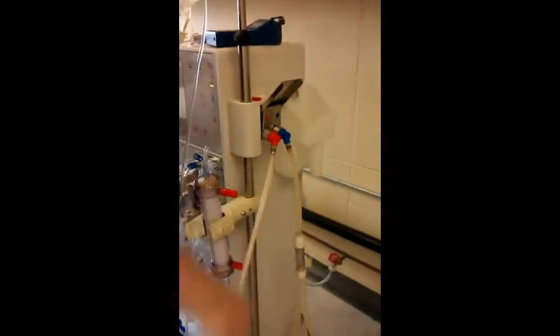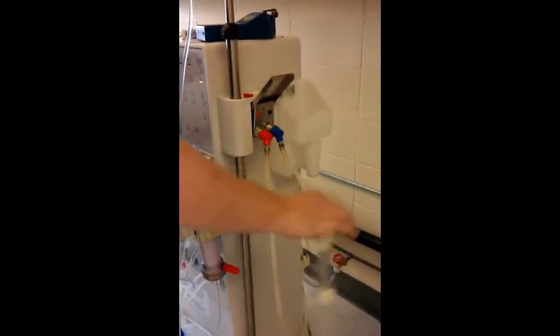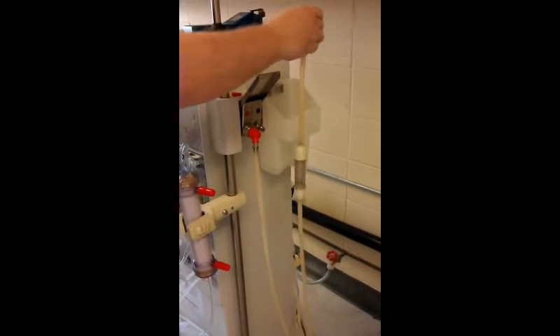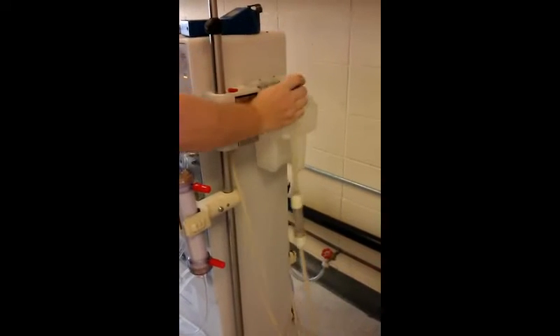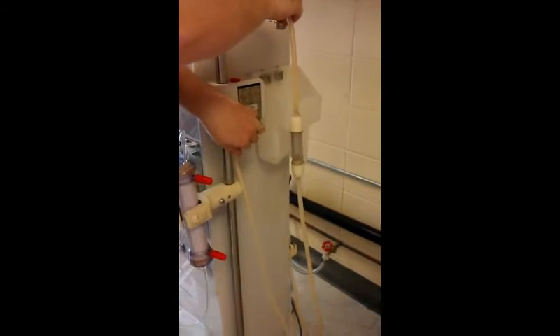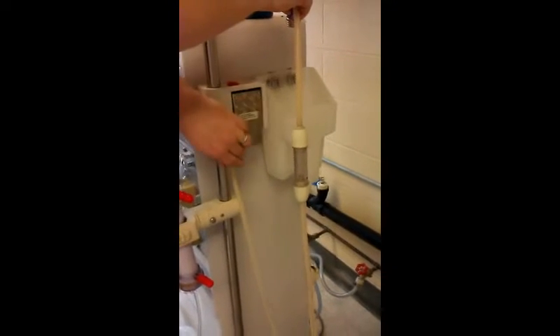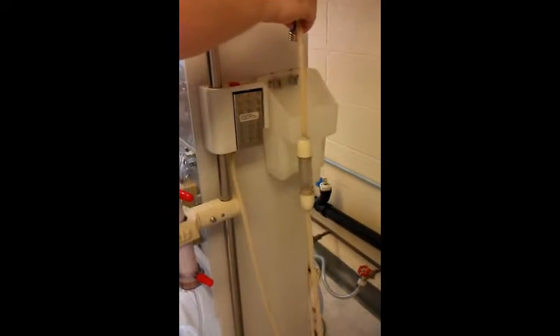There are two lines on here. This line is the drain line, or going to the drain, and this is the supply line. We need to take the supply line off, and when we take that off and close the door, fluid starts to flow through here. You can see when the fluid's flowing — open the door and it stops, close the door, fluid flows and it closes.